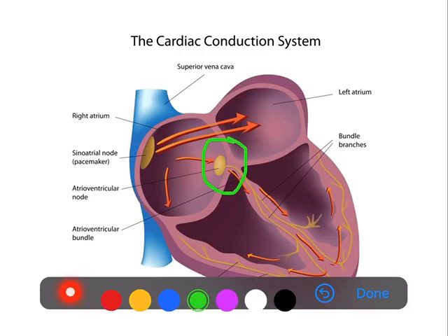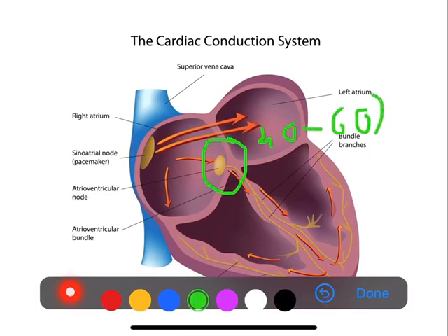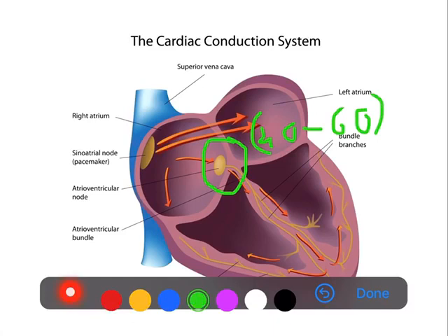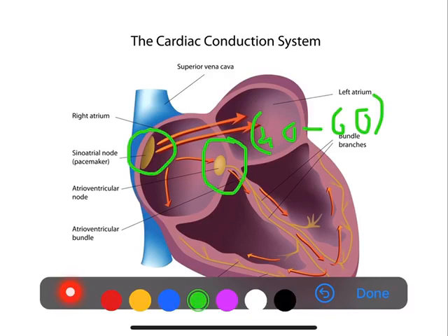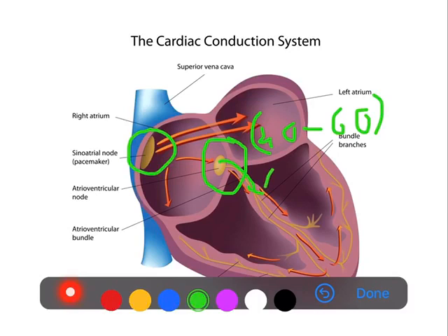The rate in junctional escape rhythm will be 40 to 60 per minute, which is the rate normally produced by the AV node. Also, since the impulses are produced from the AV node rather than the SA node, they will reach the ventricle faster. As a result, the PR interval will be shortened. That is the basic concept behind junctional escape rhythm.